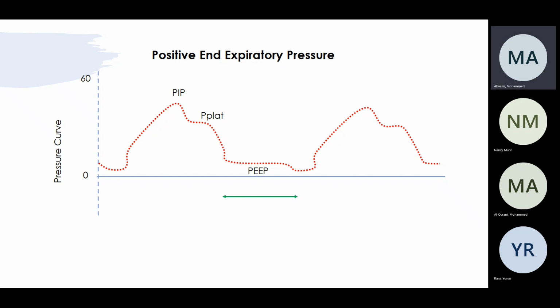So if Dr. Jasmine sent you and said, hey, can you please check what's the actual PEEP of this patient? The numbers. Okay, second year, do some math. You can go ahead. Yes, an expiratory hold. You can check. Okay, so you will do an expiratory hold. Yeah, all right. But you also need to check other numbers to know if it's appropriate or not.